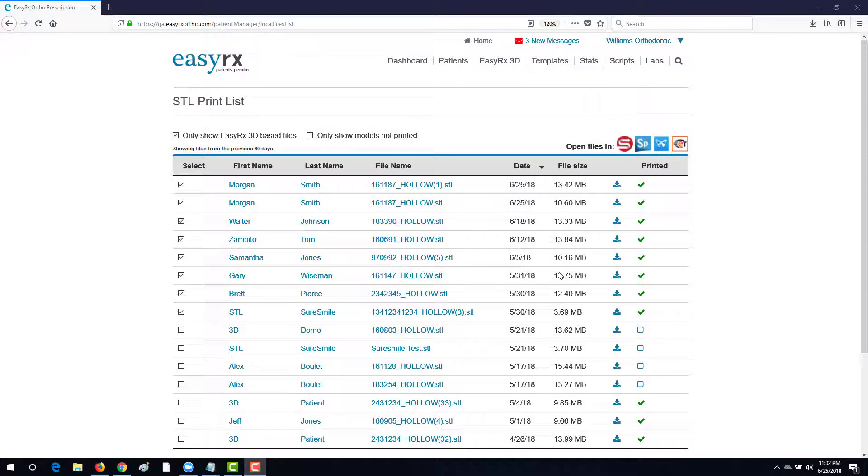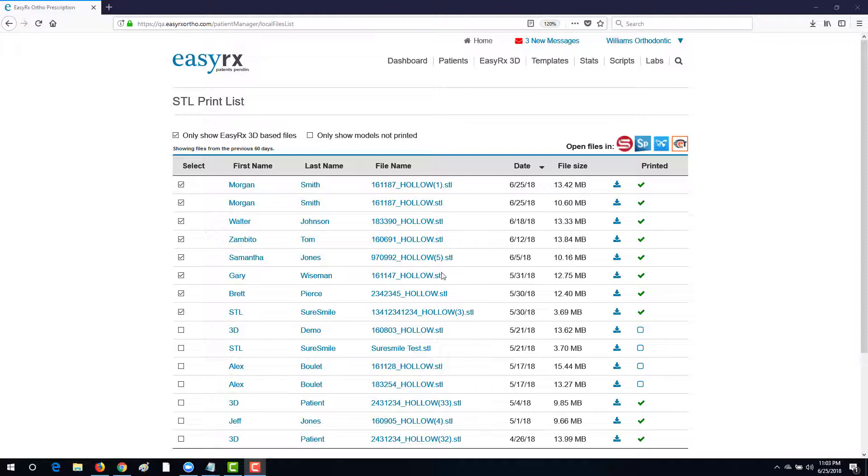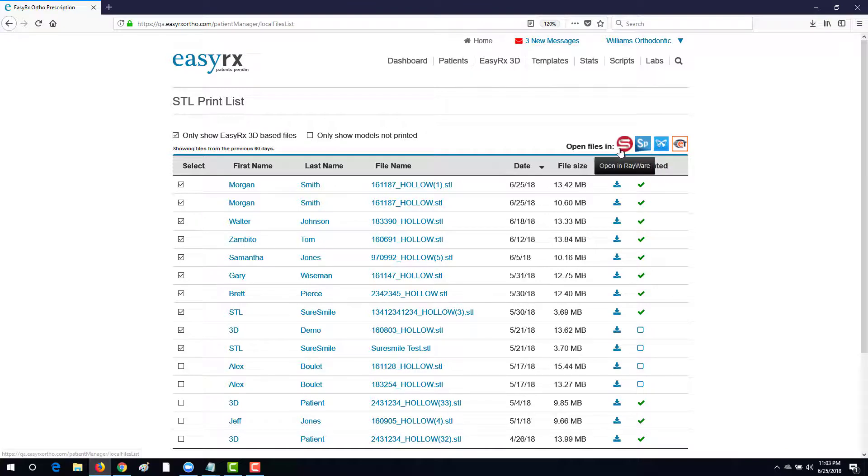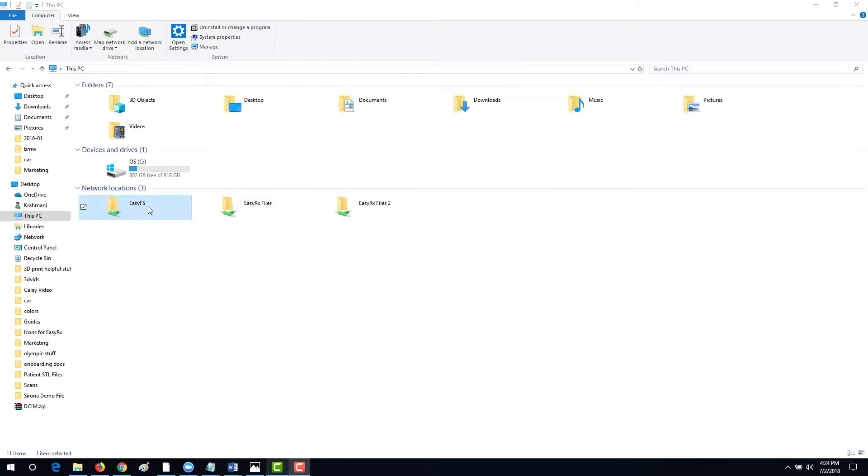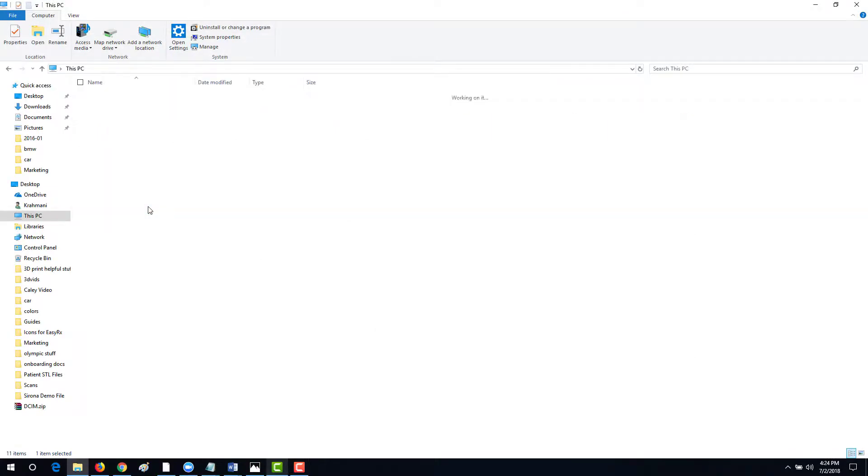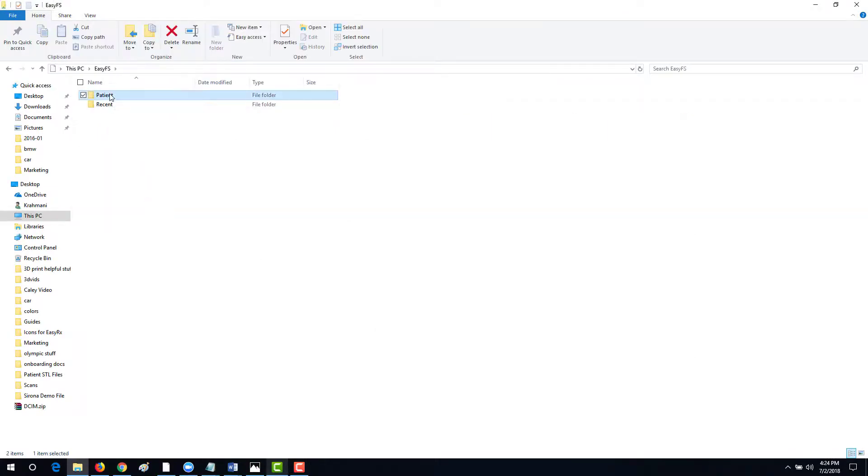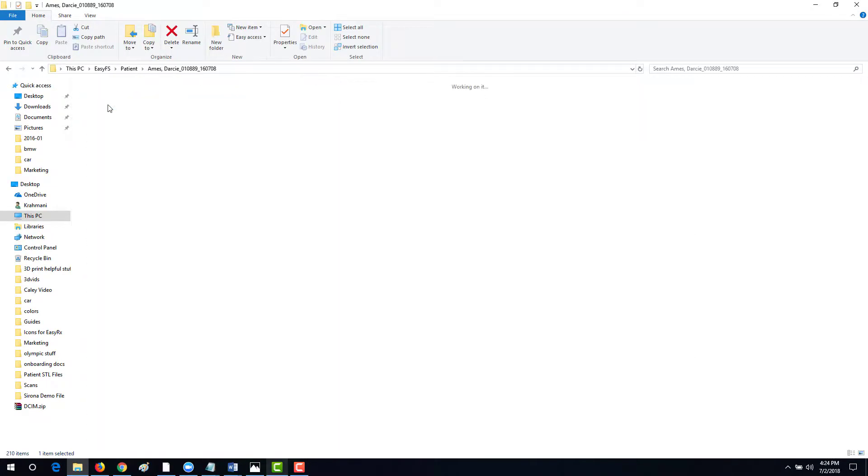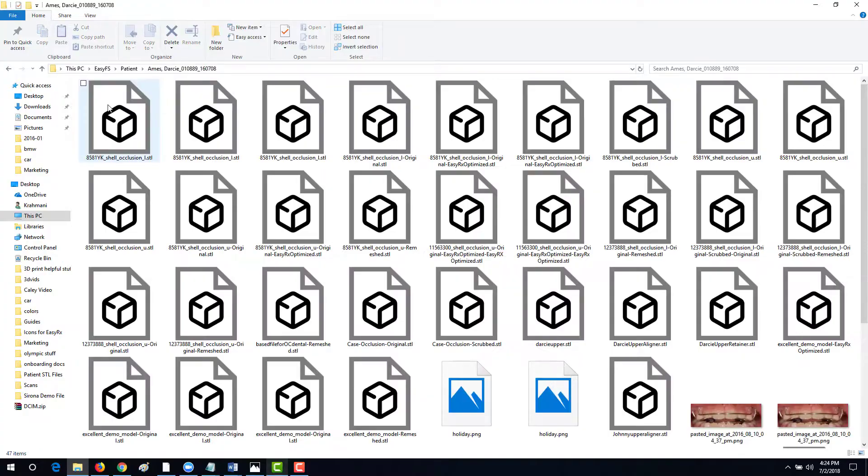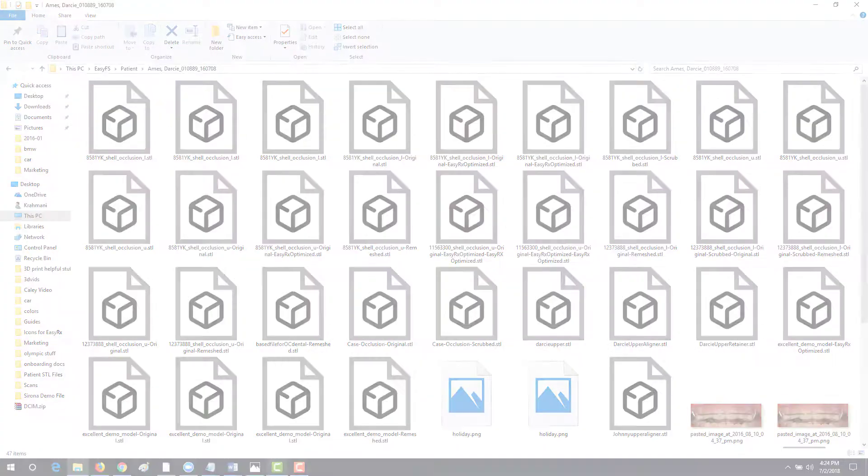Lastly, you can view and quickly import all of your finished models using the STL print list. Simply go through and check off the files you'd like to import onto your build plate and use one of the four EasyRx 3D printer integrations at your disposal. Or use EasyFS, a secure connection to all of your based STL files in EasyRx.